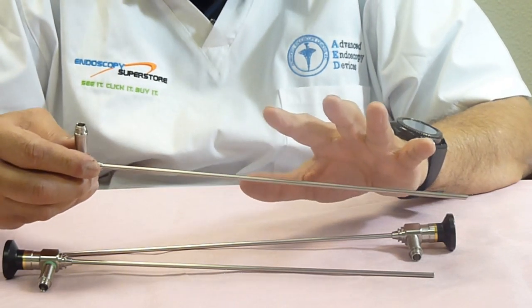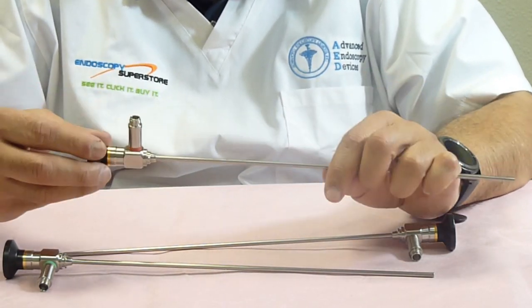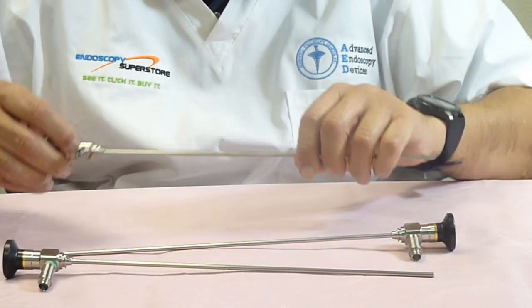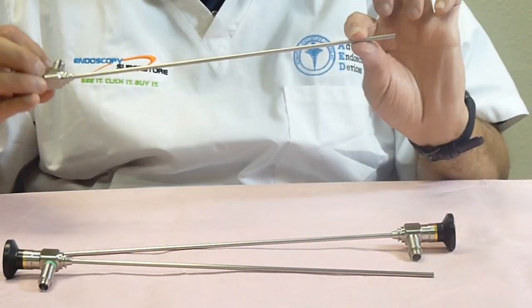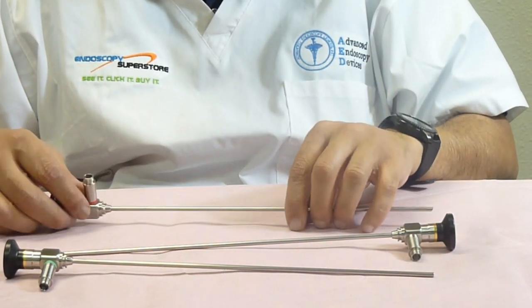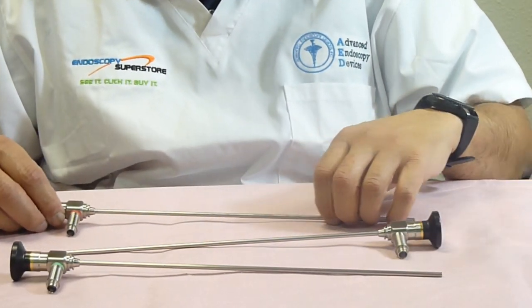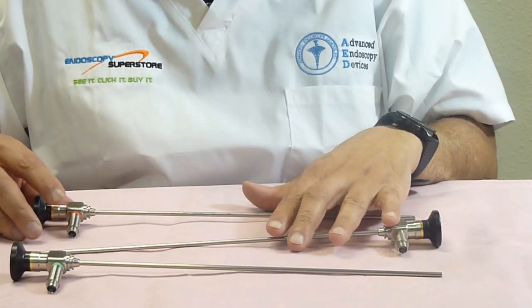Comparable to all the other manufacturers out there, you're getting an HD image, but without having to pay the HD price — because you're getting it direct from Endoscopy Superstore. We have them in 30 degrees, 0 degrees, and 70 degrees. This is our Gold Series line of rigid cystoscopes.